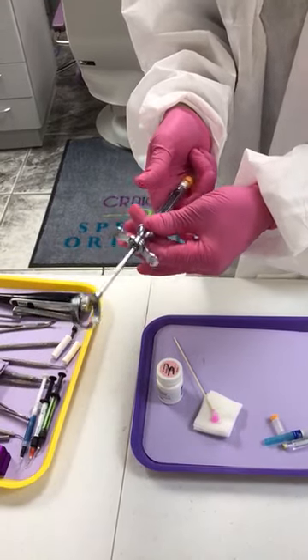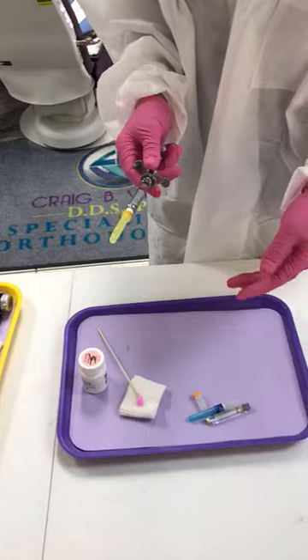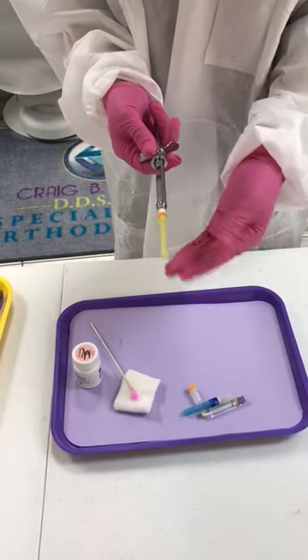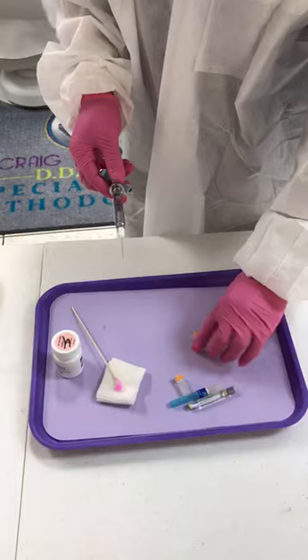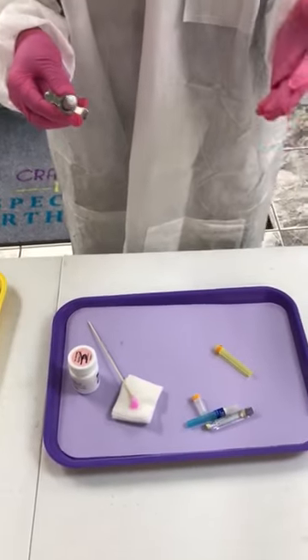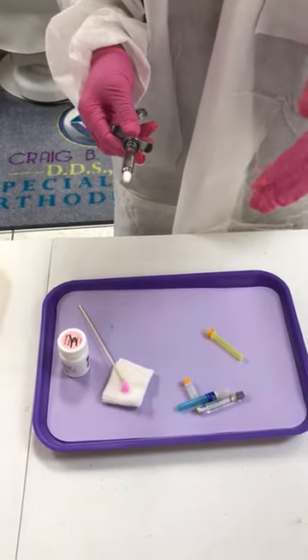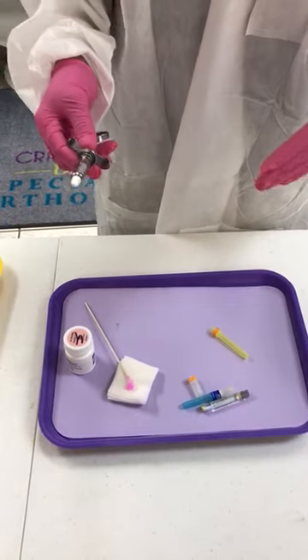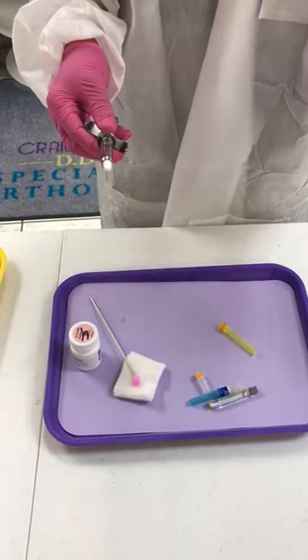Now we're going to talk about recapping the needle. Once the top of the needle cap is removed, you never use two hands to recap a needle. The reason is you can stick yourself. When you work with patients, they won't always tell you everything — any diseases or anything that's in their health history.